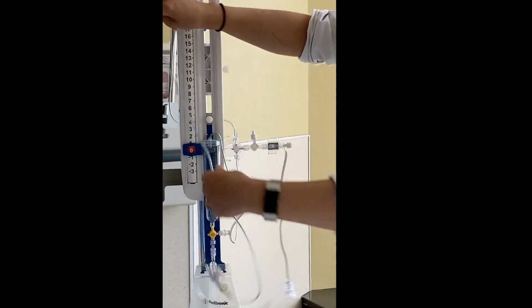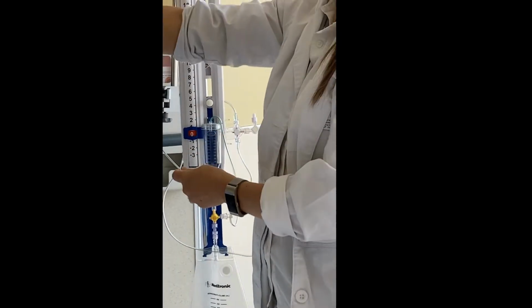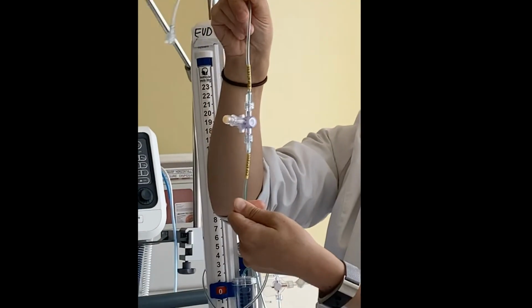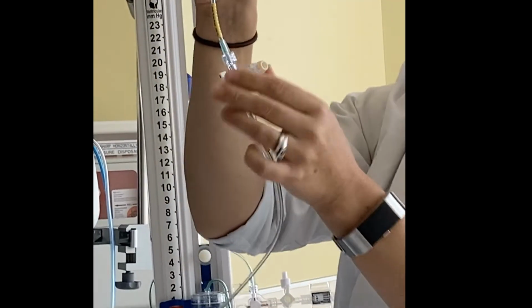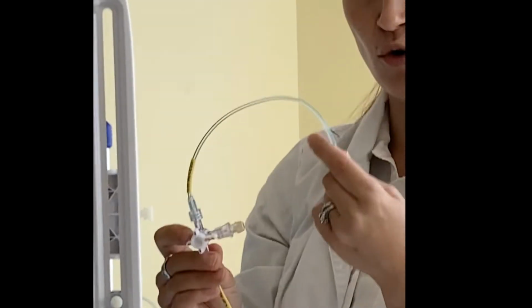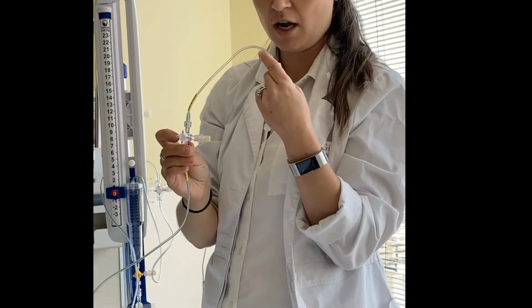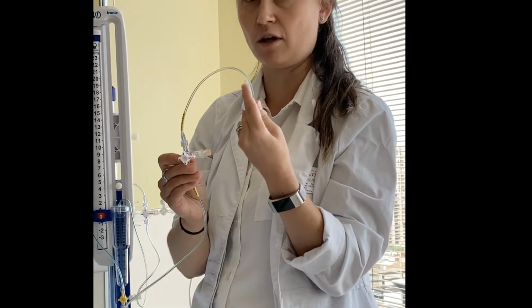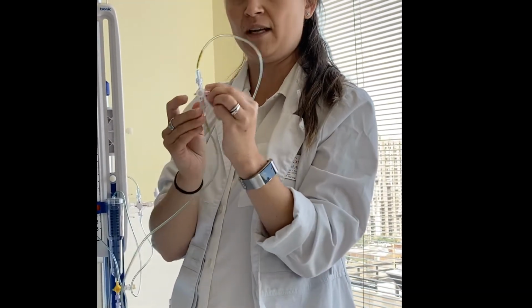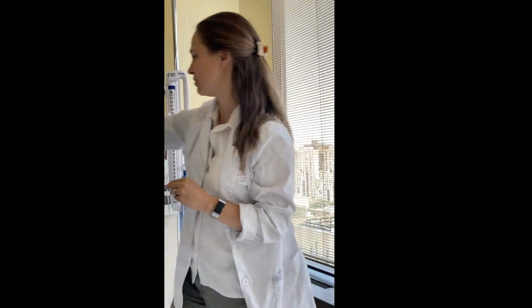This part of the system goes directly into the patient's ventricle, and you will see that it's very clearly labeled CSF Access. So when you see this, it is not a port for injection. Nothing should ever go into the patient's ventricle unless, in very, very special circumstances, an antibiotic administration is prescribed or some sort of an anti-clotting agent. This is not something that you would be doing on your own. So this should never be accessed other than for CSF sampling. And that would rest over here.